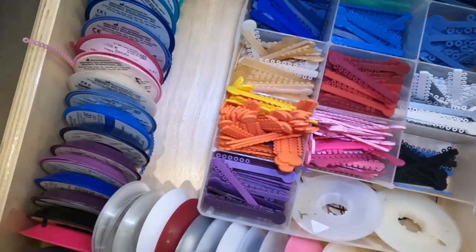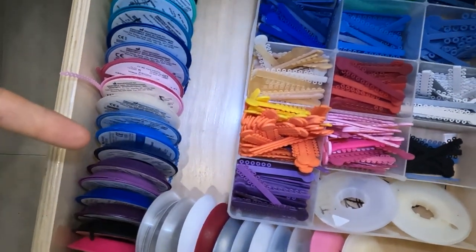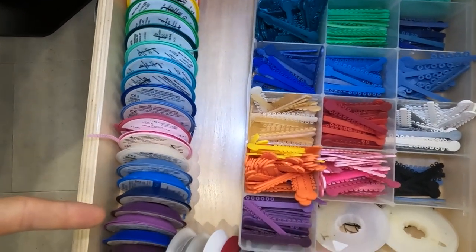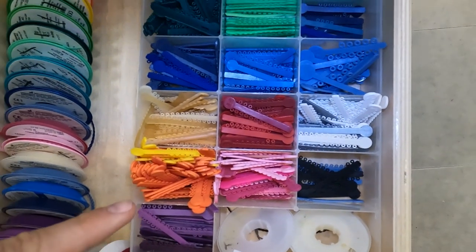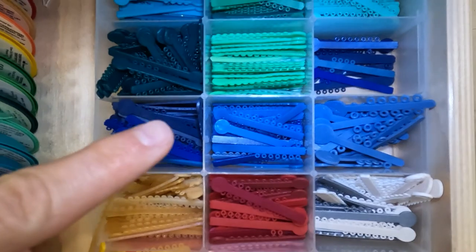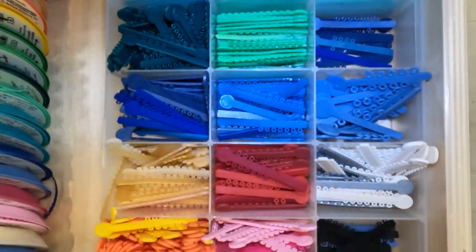Made it into the clinic. I'm gonna show you colors and power chain. Here we go — we got power chain over here, all these different colors. The power chain is used to squeeze spaces down. Then you have these, what we call elastomers or single ties, little donut-looking shapes that go around the brackets.